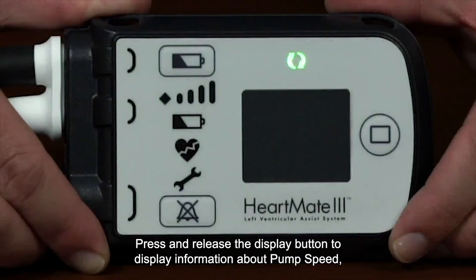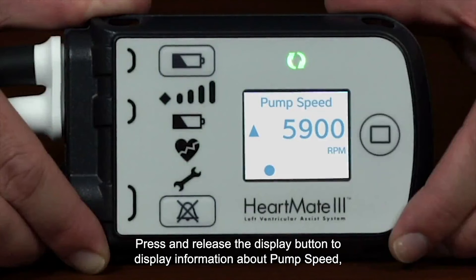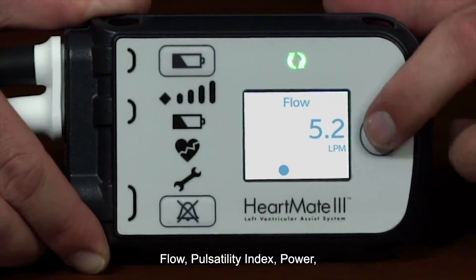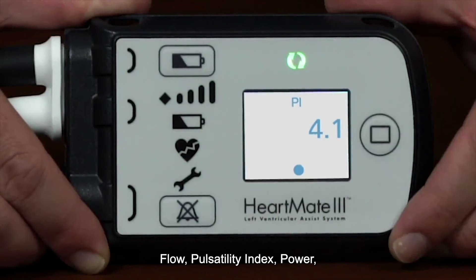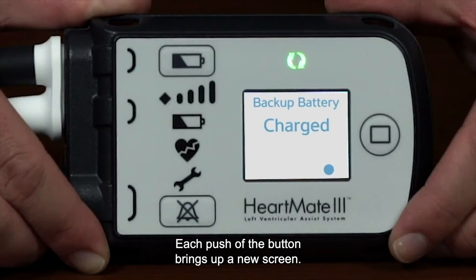Press and release the Display button to display information about pump speed, flow, pulsatility index, power, and the charge status of the controller's internal backup battery. Each push of the button brings up a new screen.